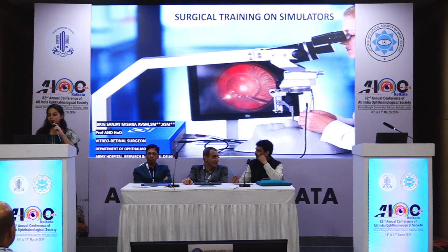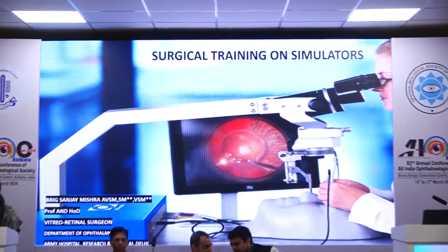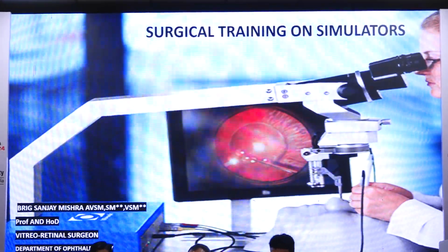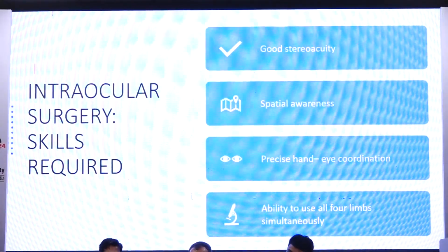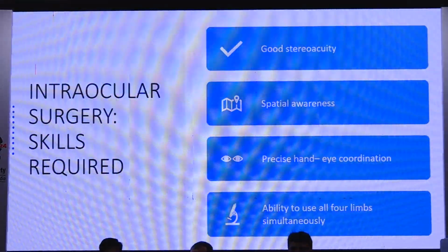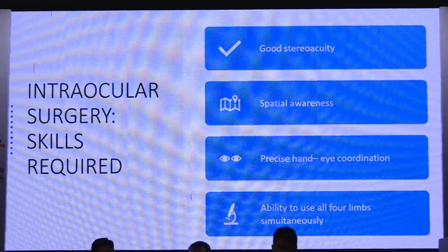So simulation has been widely used to great effect in many high-risk industries and is well validated in a number of medical disciplines. As we gather here to discuss standardization of training methodology, introduction of surgical virtual reality simulator deserves a mention. Good stereo acuity, spatial awareness, precise hand-to-eye coordination, and ability to use all four limbs simultaneously are the quintessentials for performing an uneventful intraocular surgery.